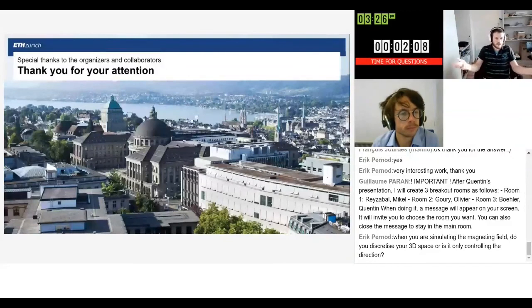what they are because you generate a set of currents. But usually what you do is you control the 3 components of the magnetic field at one position. If you add more coils, you can also control the gradient, so the way the field is changing along space. You have very different ways of doing that, but think about it as a robot where the inputs are the currents in electromagnets.